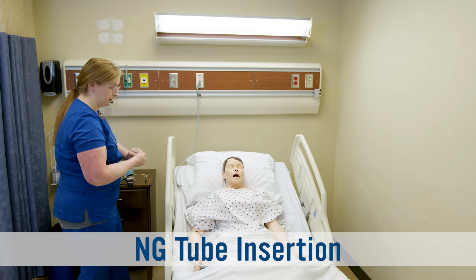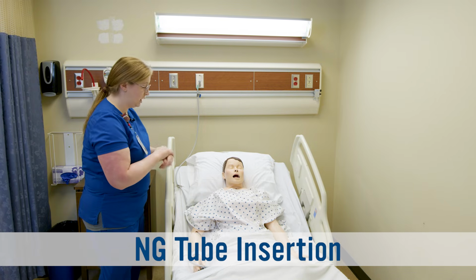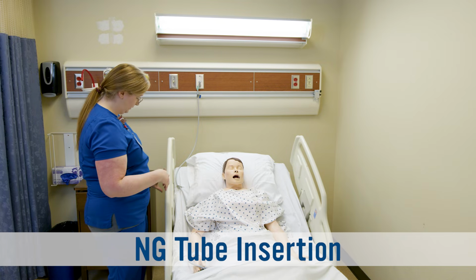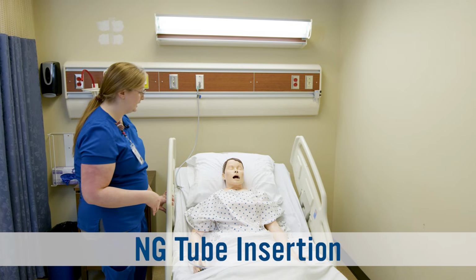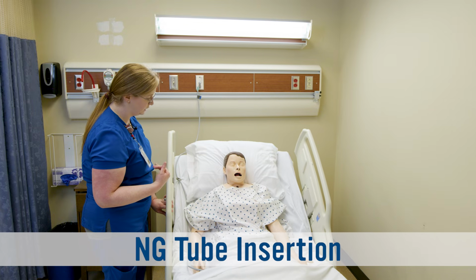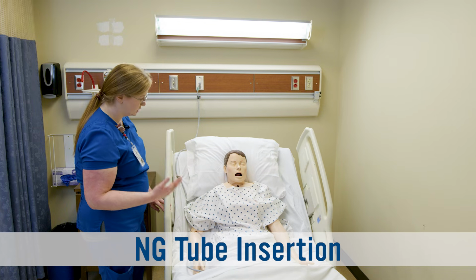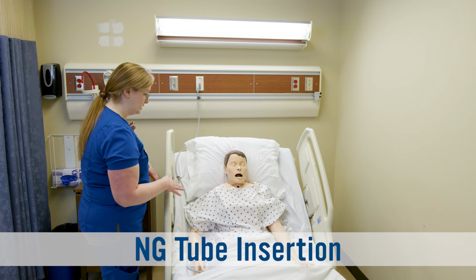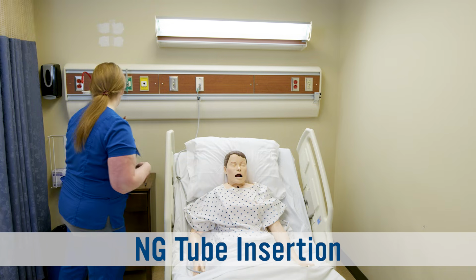I will also have someone come in and help me. We'll kind of walk you through it. So we're going to have you sit up. We're going to sit you up a little bit higher. Then we're going to start putting it into your nare. And then once we hit the back of your throat, I need you to kind of tuck your chin down and begin to swallow. We're going to have a cup of water for you, but we're also going to put a drape on you just in case we get any liquids on your chest.